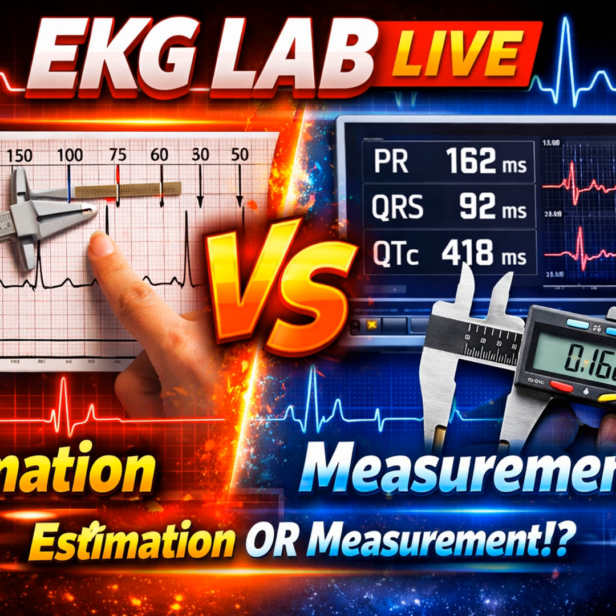Or look at ARVC, arrhythmogenic right ventricular cardiomyopathy. The source describes epsilon waves, little wiggles or blips at the very end of the QRS complex. Epsilon waves are notoriously hard to spot, I'll grant you that. A gestalt glance misses a tiny wiggle. A rigorous box-by-box inspection of the QRS termination reveals the pathology. You have to zoom in, you have to care about the voltage. That is a compelling argument regarding rare genetic conditions. But have you considered that System 1 thinking, that gut feeling, is actually built on the accumulation of those rigorous inspections? You are describing the learning process, not the expert process.